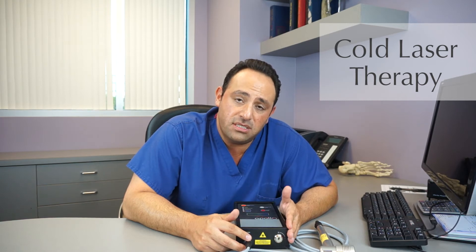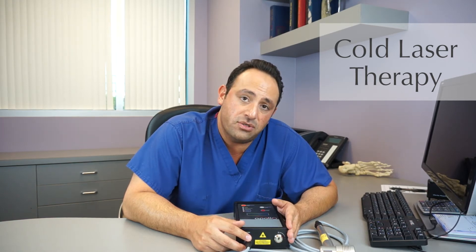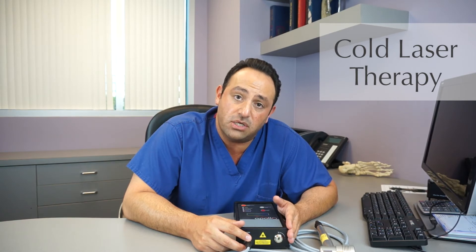One of the main questions asked is: does the laser hurt? The cold heat laser does not hurt at all. The patient has no sensation because it's a cold heat.